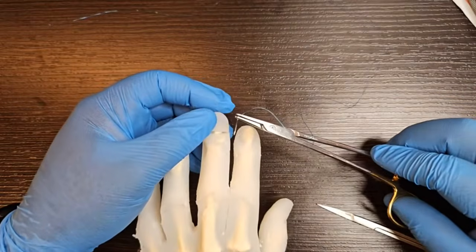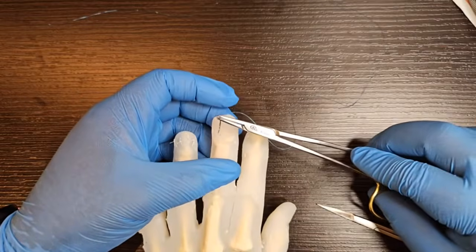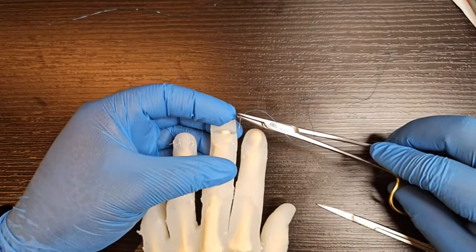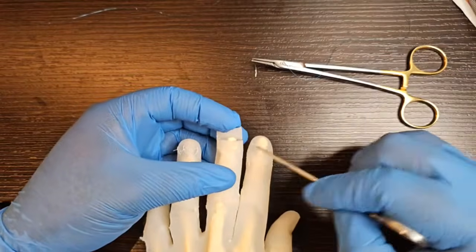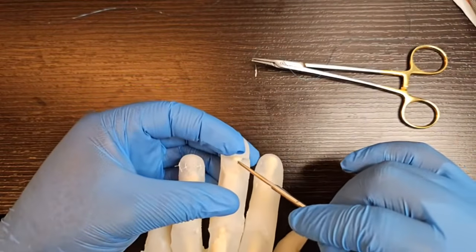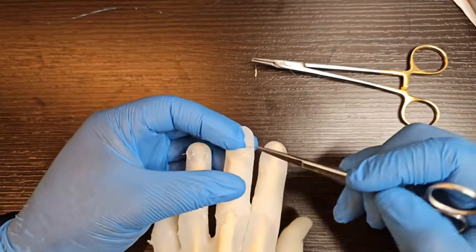Now we need to talk about where we start. So when you're doing nail bed repairs, you don't start your suture on the matrix. You start on the pulp. If you need to do K-wires, this is the time to do it. So you do a good wash. You can see your fracture. I haven't got a fracture here. I can see the bone, and I've done an x-ray before, so I know I haven't got a fracture.